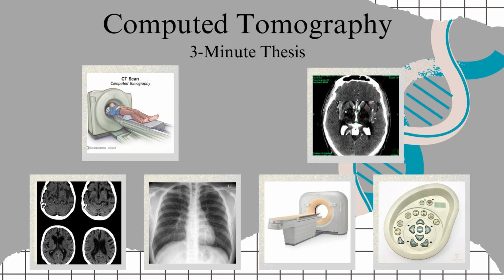CT scans are widely used in medicine for various purposes, such as making diagnosis, planning, monitoring, and emergency medicine. Diagnosis is crucial for detecting and diagnosing conditions like fractures, tumors, infections, and internal bleeding. CT scans are essential for planning surgeries and radiation therapy by providing detailed information about the size and location of abnormalities. Doctors use CT scans to monitor the progress of treatments, such as cancer therapy, by comparing scans taken at different times. In emergency situations, CT scans can quickly assess injuries to the head, chest, abdomen, and pelvis, aiding in swift medical decisions.